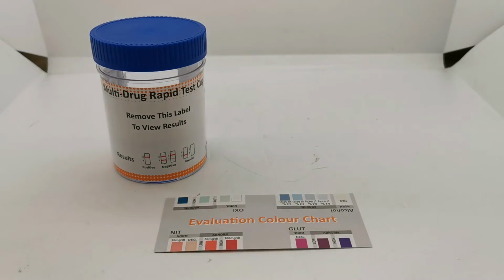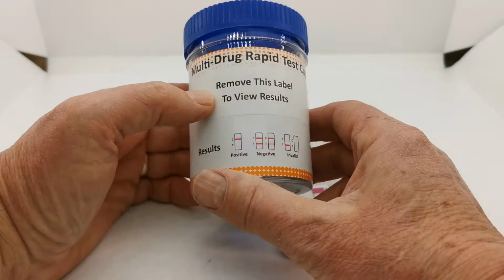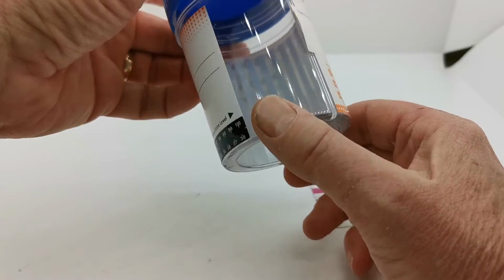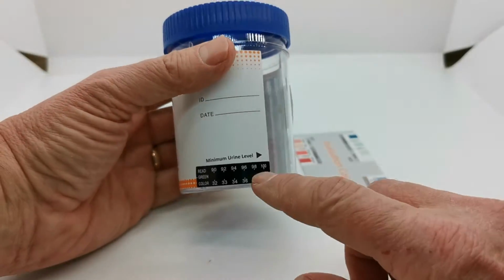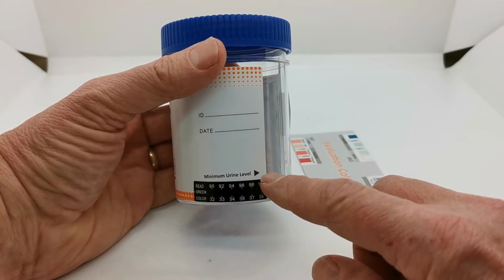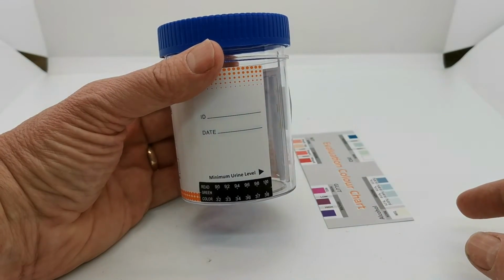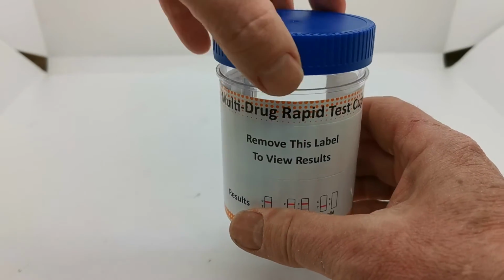Now if I just remove that for a second and show you the actual cup, we'll come to the card in a minute. This cup design is a standard screw lid cup with the drug test, as you can see just through there, positioned peripherally around the circumference of the test. Now importantly on this test we have a minimum fill level for the sample. You'll see this is quite low, but it is important when the donor is asked to provide the urine sample into the cup that this level is exceeded. Doesn't matter how far up above this it comes, but ideally not too close to the top because you don't want to have any spillage.